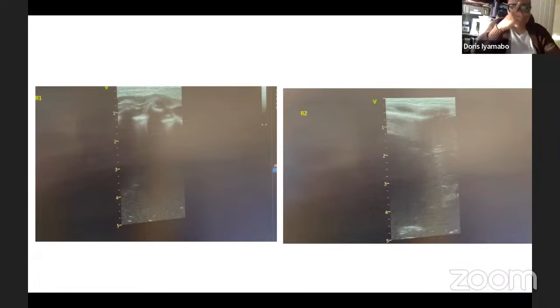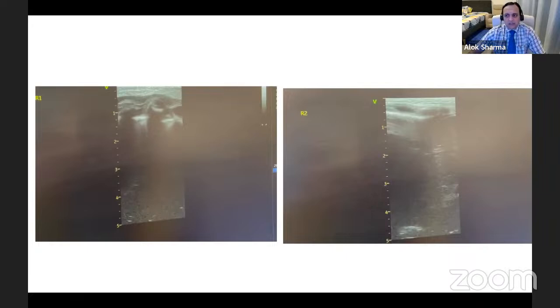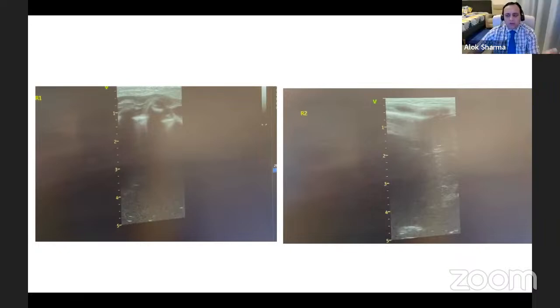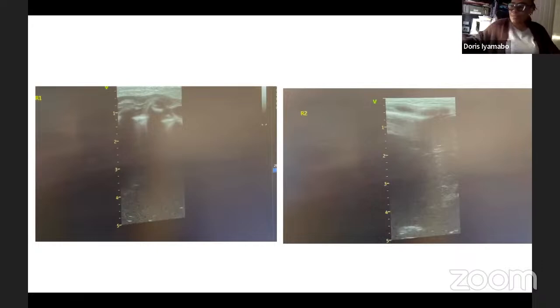Okay, so it's really easy and you can anonymize them. Once you've completed the scan, you go to Image Viewer on the top right-hand side. On Image Viewer, you click it and you'll have a select all option. You click select all, export to USB, and it will automatically anonymize your images. The GE, when you export to USB, automatically anonymizes all images, when you export them as AVIs. As AVIs, let me write that down. Yeah. That sounds pretty easy.